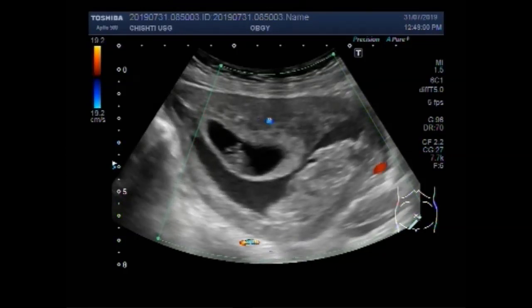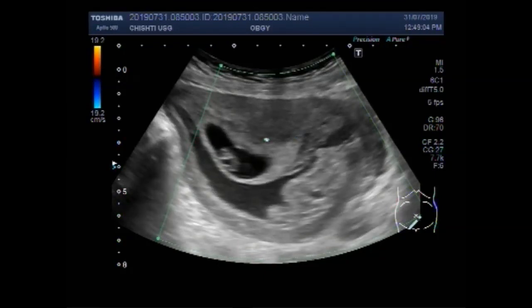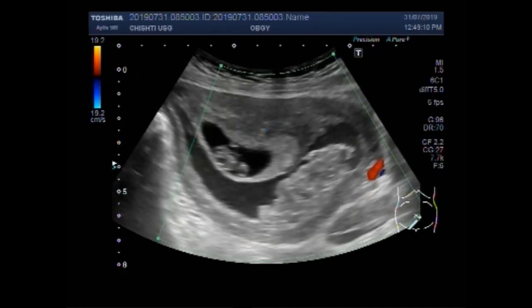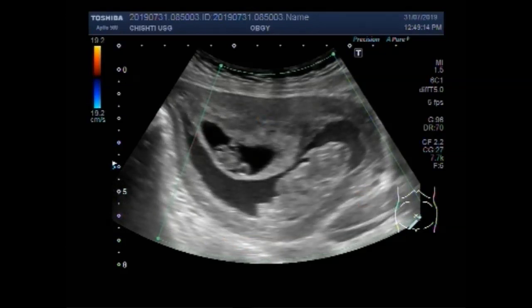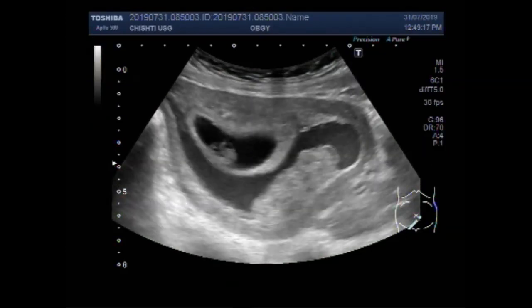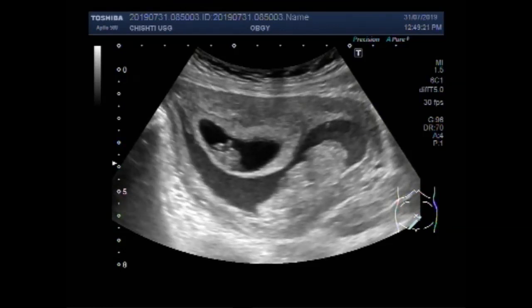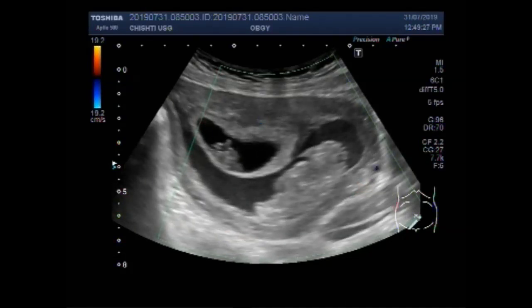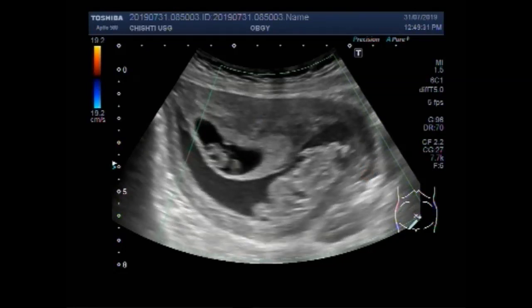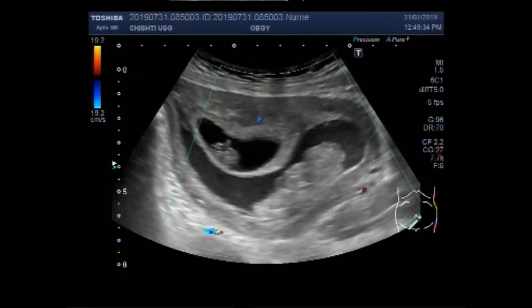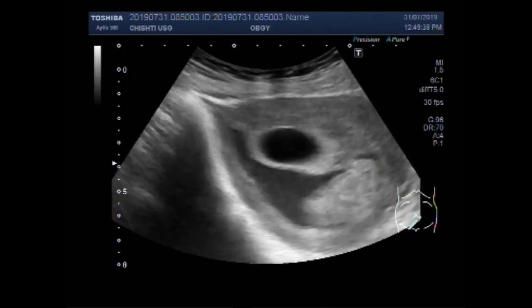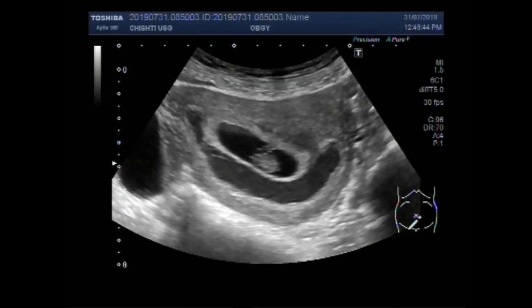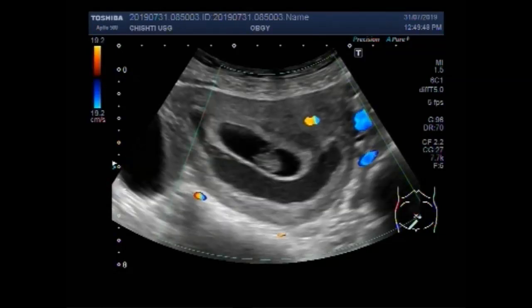You can see blood flow is also seen in this fetus, along with cardiac activity. Now you can see the cardiac activity, and now you can clearly see the fetal cardiac activity.